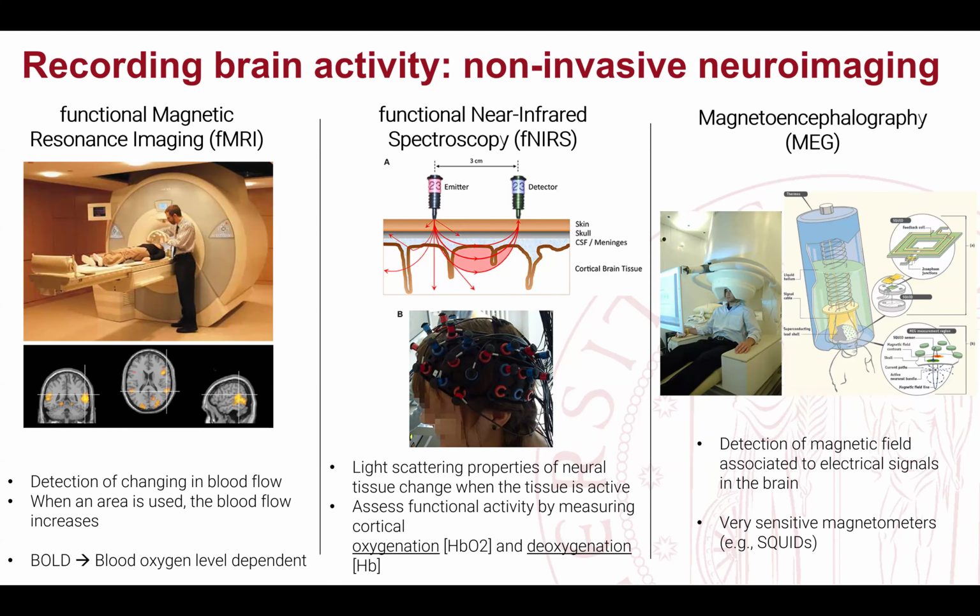These are all based on, let's say, the blood flows, still related to the electrical activity, similar to the EEG. There is the magnetoencephalography, which uses instead the primary current, not the secondary current that I presented before, because this primary current within the neurons produces a magnetic field. This magnetic field can be captured by magnetometers. So by looking at the difference of this magnetic field, we can have a signal which is very, very similar to the EEG one, but much clearer and less affected by noise.